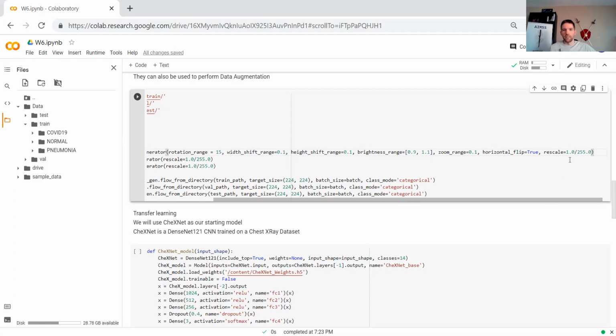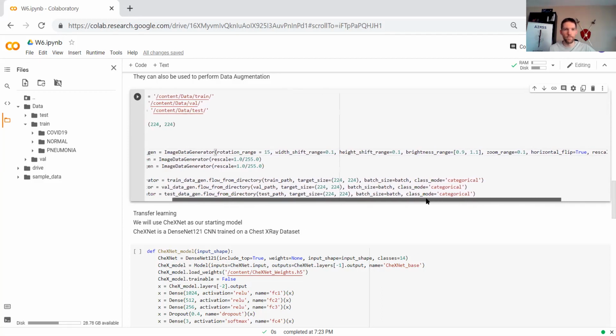If you ever go to the color picker on Paint, or anytime you're choosing a custom color, you can input your color values, and usually you can put a number in from 0 to 255. So we want to convert that range to a range from 0 to 1. So we're going to divide every value by 255 in that image, and that'll rescale it from 0 to 1.